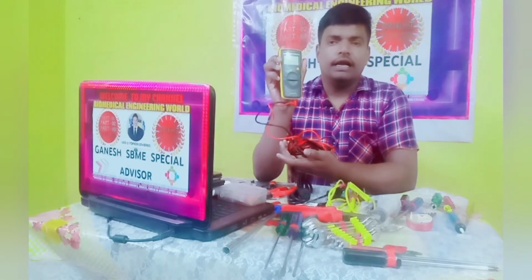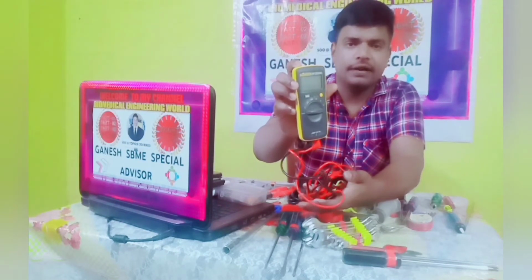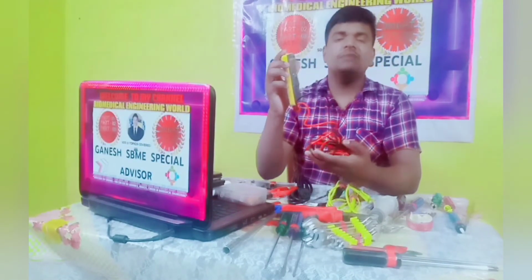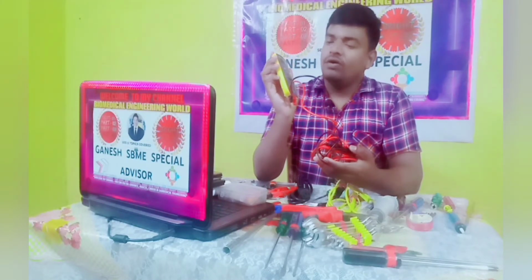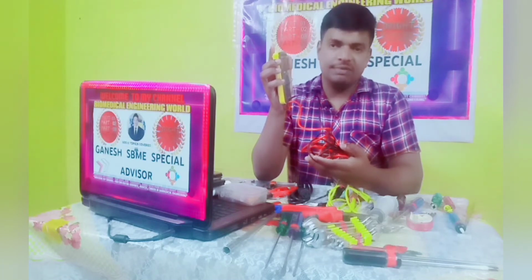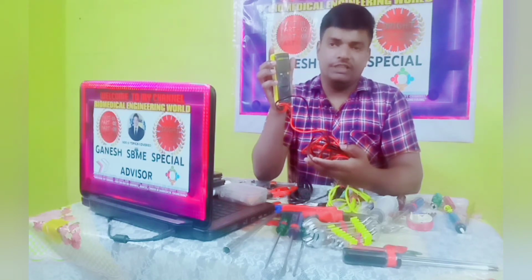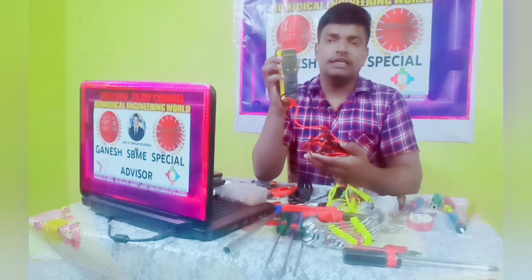See, this is a multimeter, a Fluke model, and different companies' models are available in the market. With any multimeter, we can check continuity, component ratings, functioning of the PCB board, and the basic condition of the equipment. For all medical devices, we need to check this.